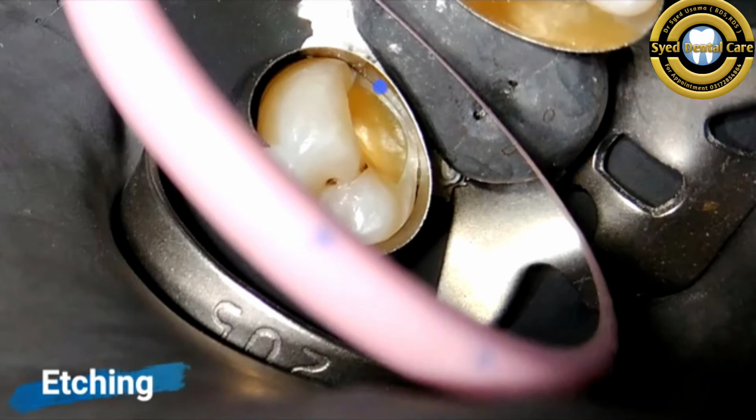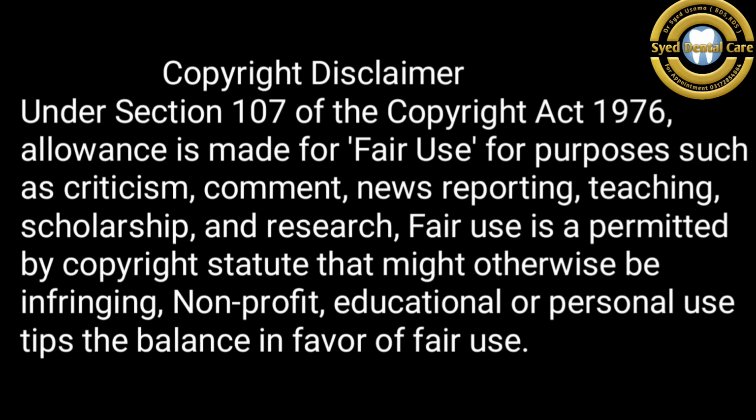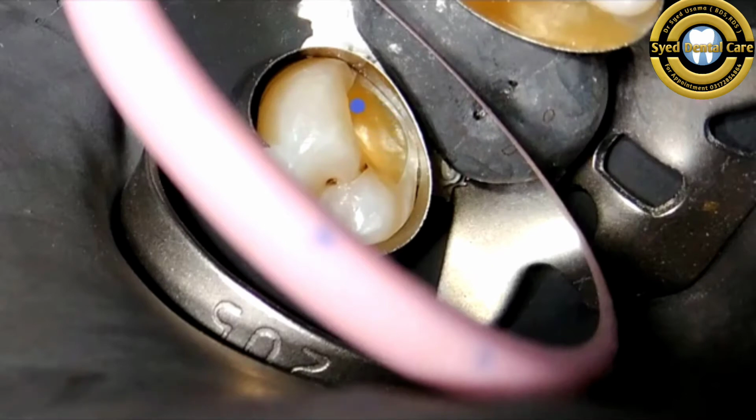Selective enamel etching was carried out on the periphery for around 30 seconds and on the dentine for 10 seconds, and then thoroughly rinsed. After rinsing, the tooth surface is dried using an indirect air blast. Then we apply the bonding agent and scrub on the tooth surface, and this was evaporated using a gentle blow of air. Here we are using composite as our restorative material.